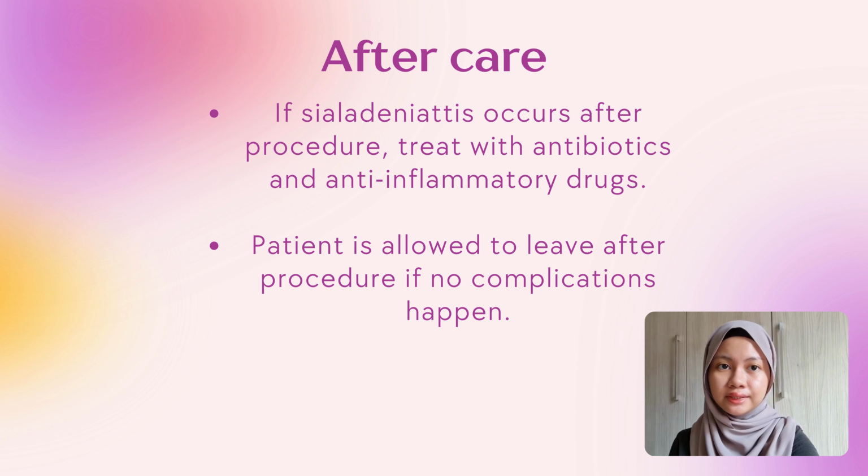So the procedure is fairly simple, therefore there is not much aftercare needed, unless giving antibiotic or anti-inflammatory drugs if sialadenitis occurs. Other than that, the patient is allowed to leave.